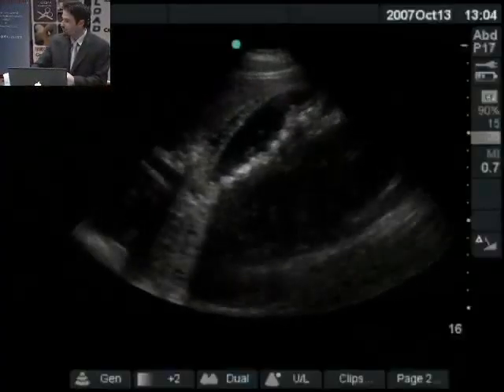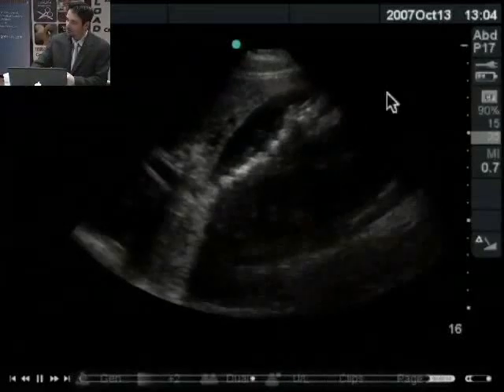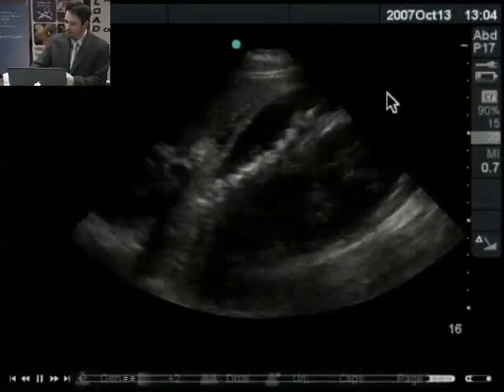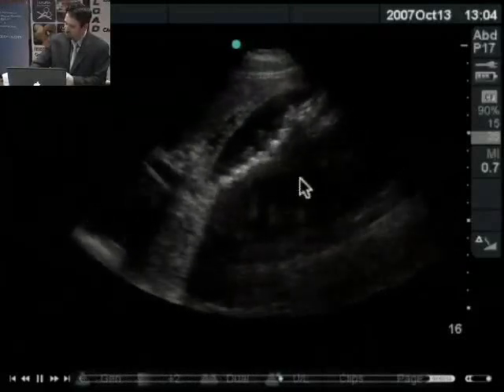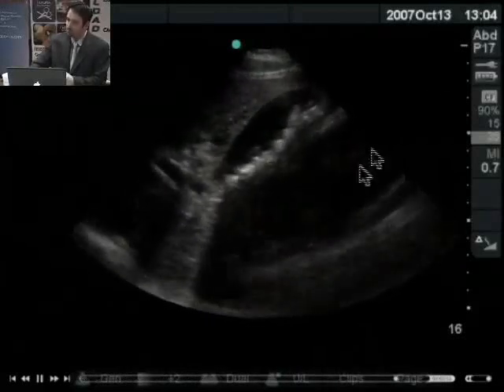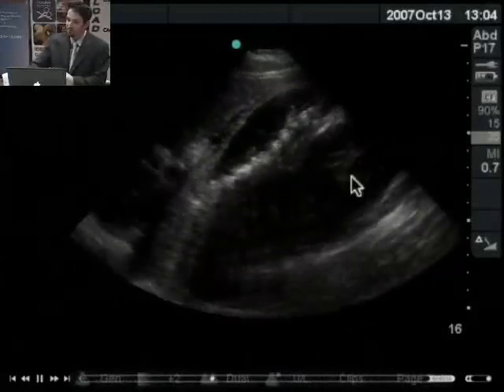Here's a gallbladder that's just riddled with stones. All these white structures, stones that have gathered, they're layering on the bottom of the gallbladder, and they're casting this dense shadow beyond them. It's almost like a curtain of shadow that occurs underneath this. Kind of obliterates the structures underlying the gallbladder. You can't really appreciate them.